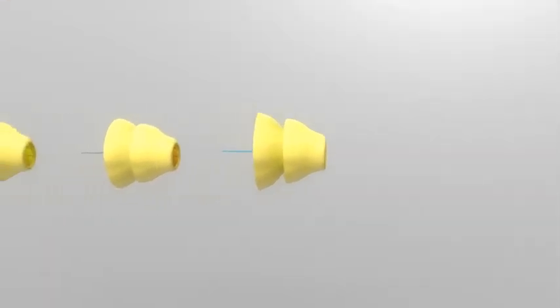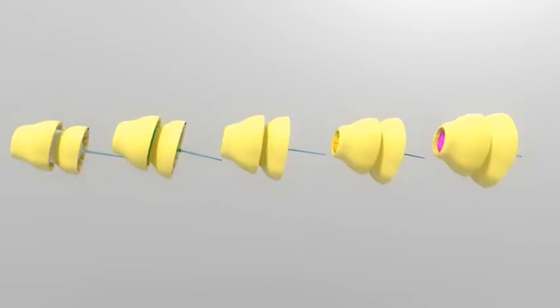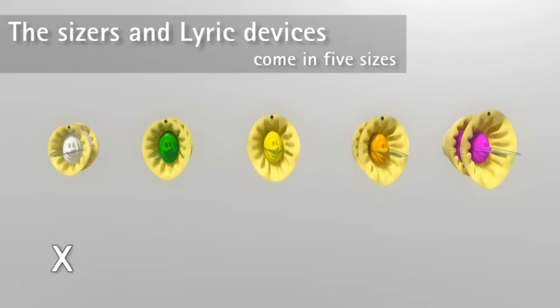Lyric device size. The device sizers for Lyric are replicas of the devices. The handling and placement is the same as for an actual device. The sizers and Lyric devices come in 5 sizes and are not right or left ear specific.